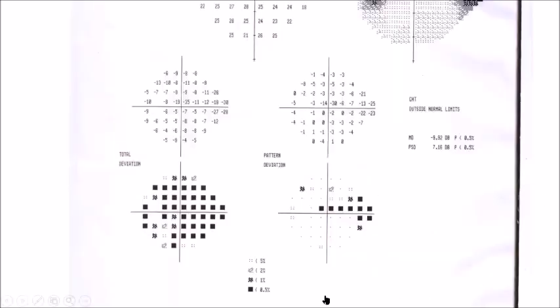Let me show you an example here. These points are shown here to be with the same probability, 0.5. Now, you notice we get this point of -8. It is in the range of these points, which are between -6 and -30, and the -8 at this location gets this sign. Again, here you get -6 and -7, and the -6 here gets this sign, and the -7 another sign.